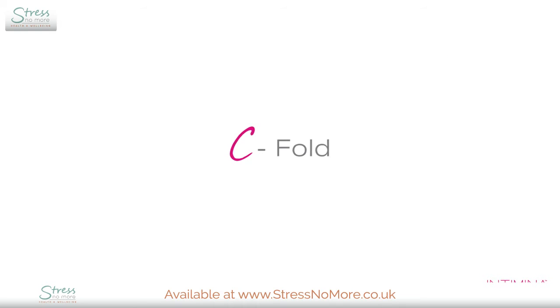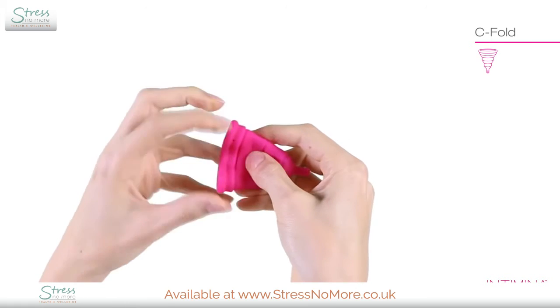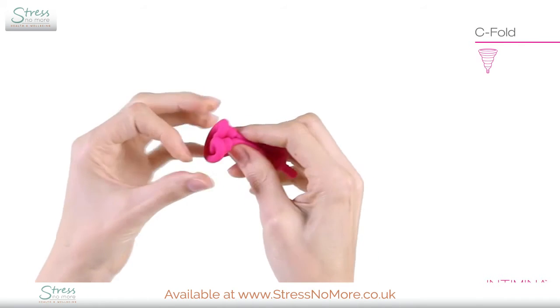The C fold is great for LilyCup Compact. You simply flatten the cup and fold it in half so it looks like a C.